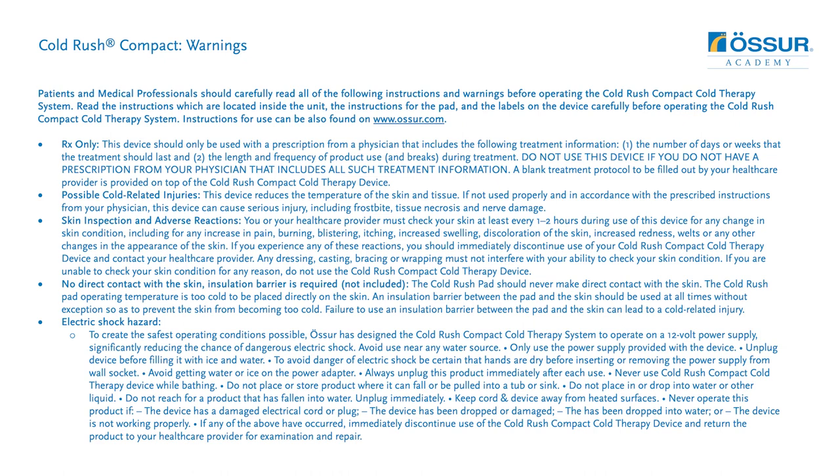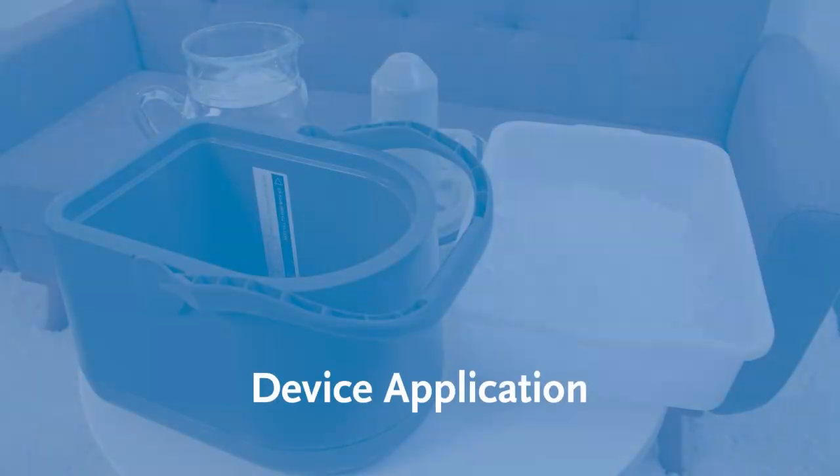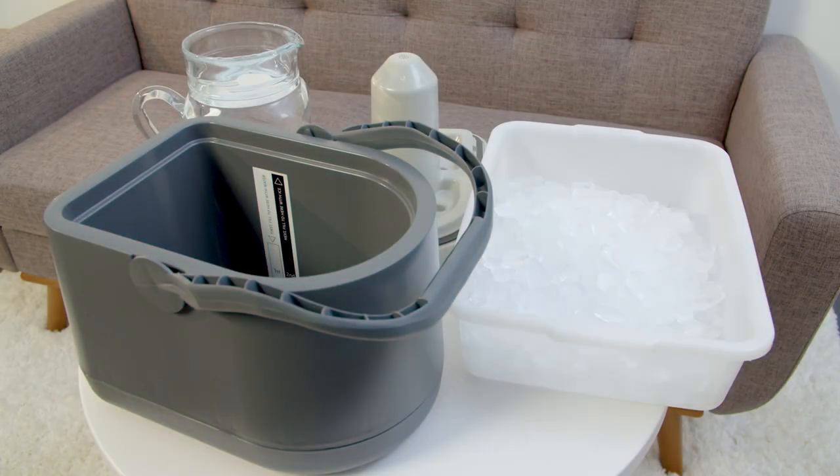The Cold Rush compact cold therapy system can be cold enough to seriously injure skin. Read the instructions, which are located inside the unit. Read the instructions for the pad and the labels on the device carefully before operating the Cold Rush compact therapy system. Instructions for use are available on www.oser.com. Do not plug the unit into the wall socket at this point.